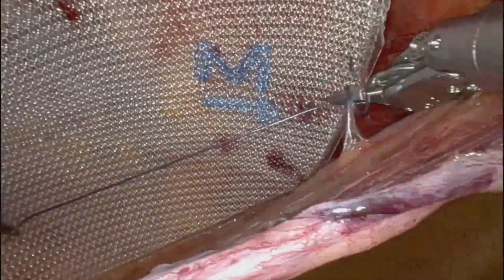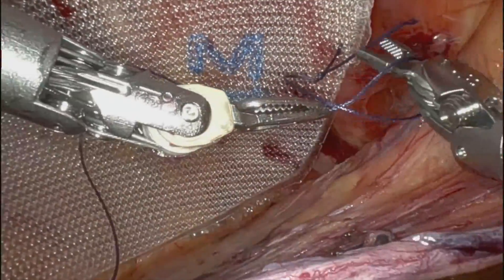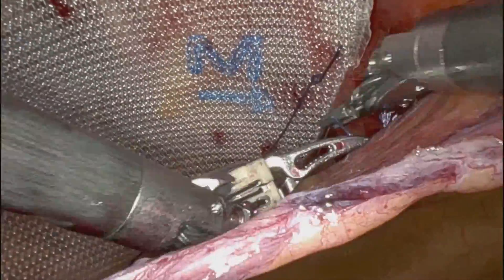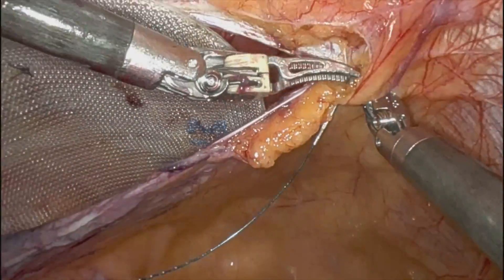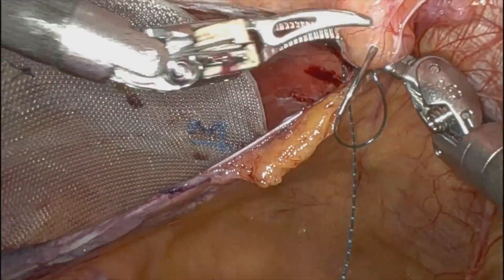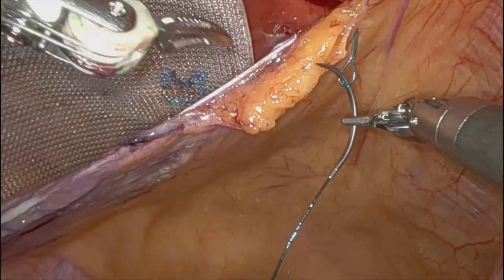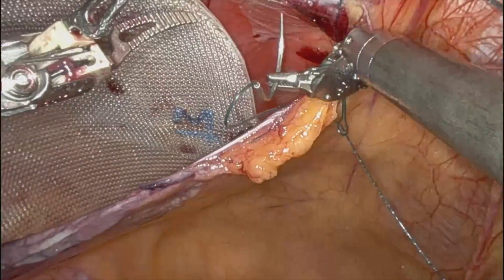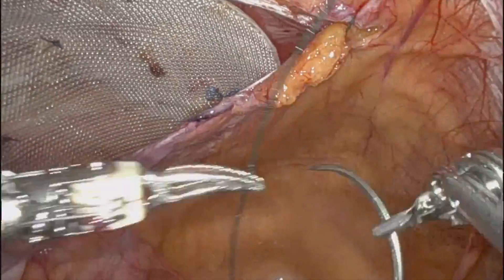That's the high medial fixation. And I'm just closing the flap now. I always try to incorporate the defect and the contents into the closure. Basically reduce the hernia sac, pull it up, take a bite of it with the needle, and suture it back onto the flap.